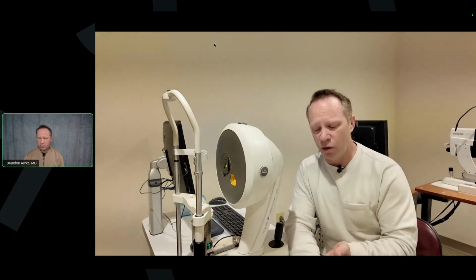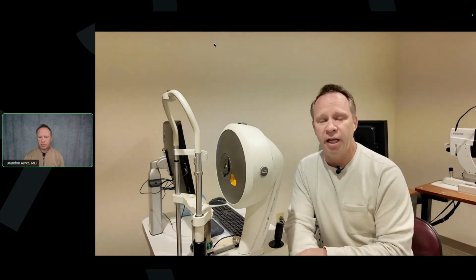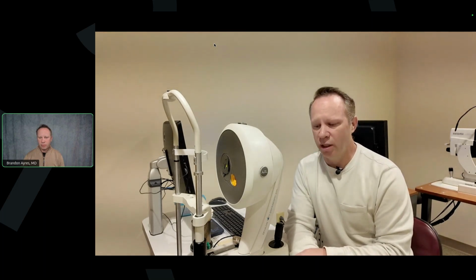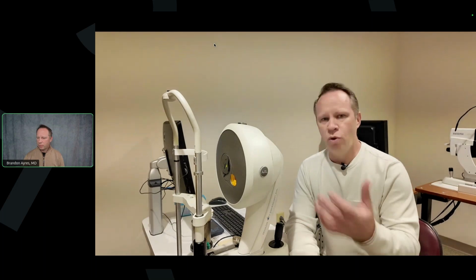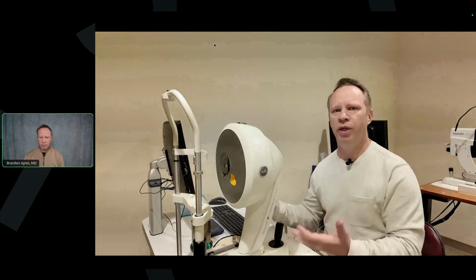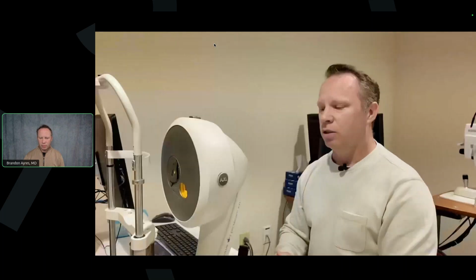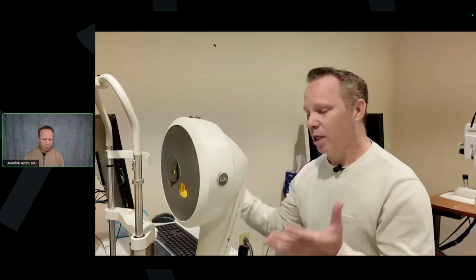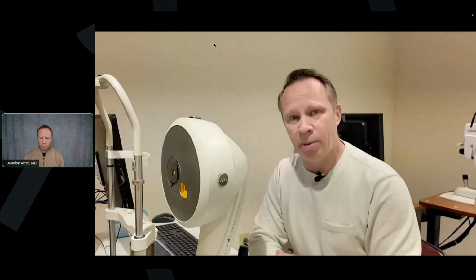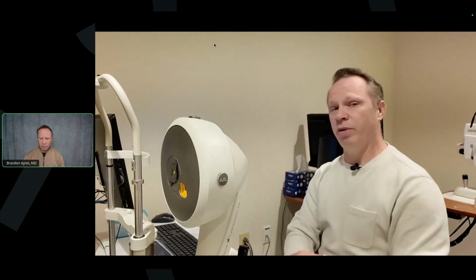And certainly we use the images to help us when we are planning out our CTAK procedures using the CTAK nomogram. So let's go over maybe a couple of patients in a couple screens just to show really what we do, or what I do, and how I think about using the Pentacam. So let's look at a couple of screens and let's see how the Pentacam can help us out when we are looking at our patients with keratoconus and maybe even planning some surgical procedures.